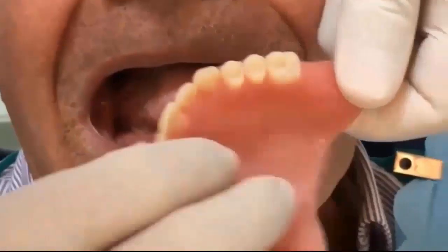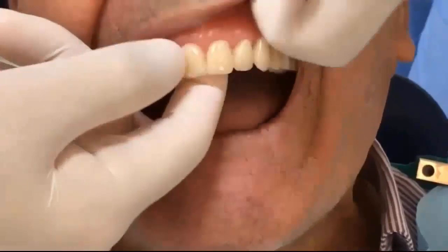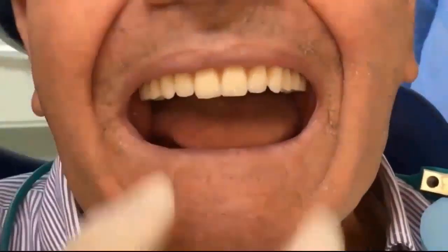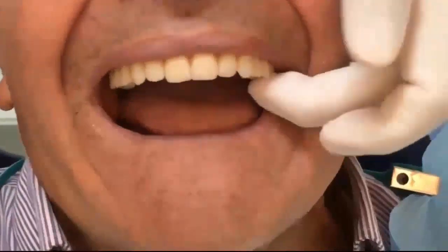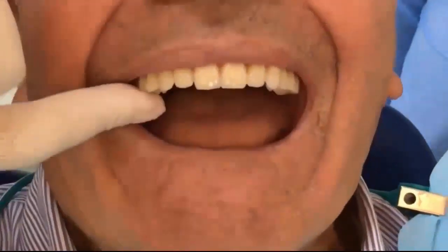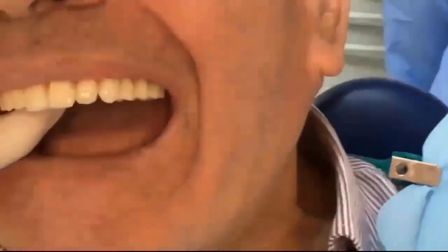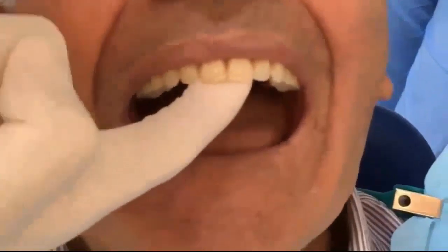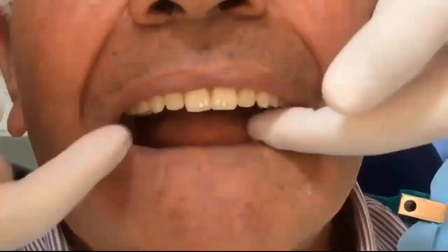I'm just going to show you another video here to show that these cases are actually not just a dream. They are actually real, working afterwards. And this is from Lucio in Italy. And he's basically showing here one of his early dentures. And he was also in doubt whether it would work. But the clinical reality is that you can see you have fantastic suction effect. Dentures are sitting great. And the question, of course, is why is that? Why is that happening when we don't have border molding here?